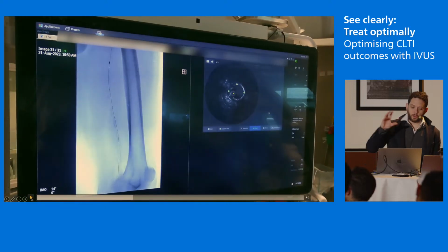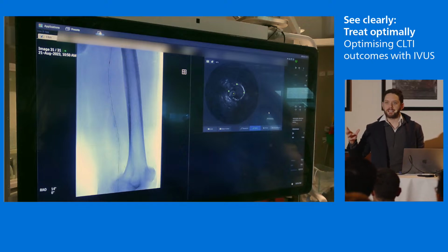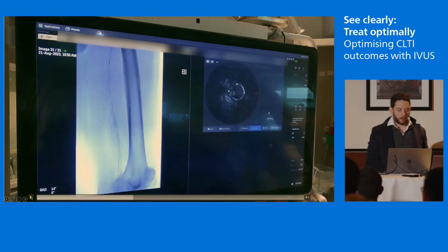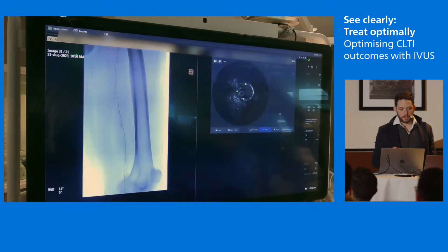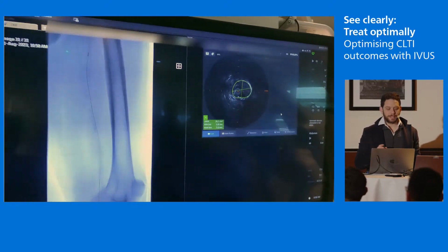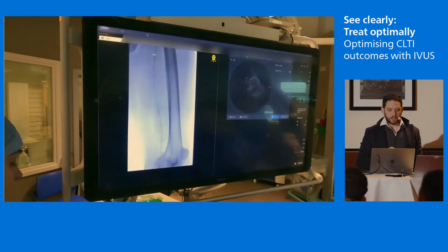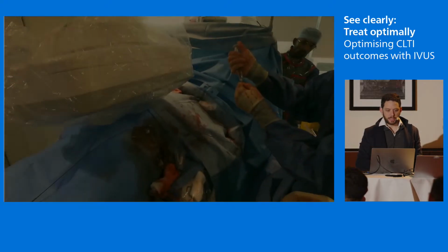The next step, once we've done that, is to work out what the healthiest RVD is. This is a FemPop case, so maybe we've already got a preconceived number in our mind, but that's fine. I'm going to stick probably a 6mm or 5mm balloon in this guy. So we do our RVD here. It's a 7mm SFA. Maybe I haven't measured it completely accurately, so we can measure at different points, go up and down, and find exactly where we think that RVD is.